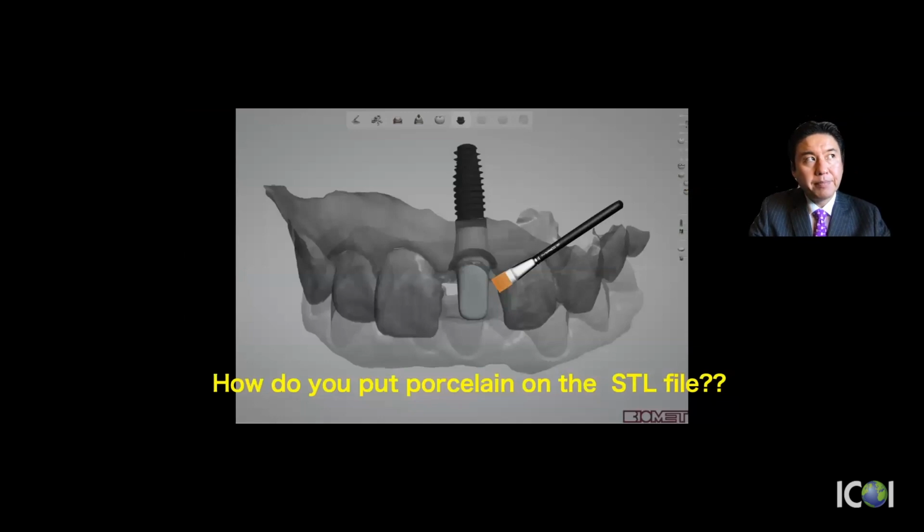And then this time, the last patient was a smoker, and also it doesn't have much aesthetic. In this case, the patient had high demand, so I want to give more aesthetic outcome for this patient. Not only a milled crown, I want to have a zirconium framework with porcelain on the top.